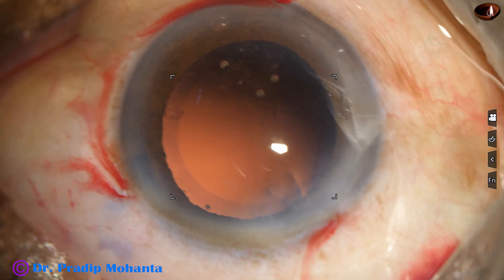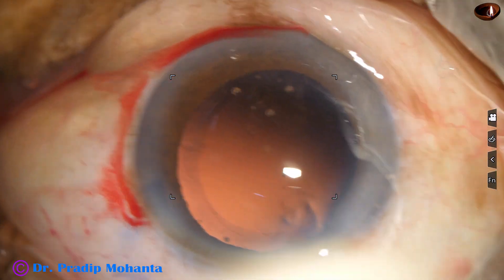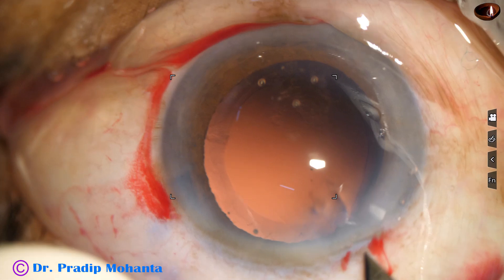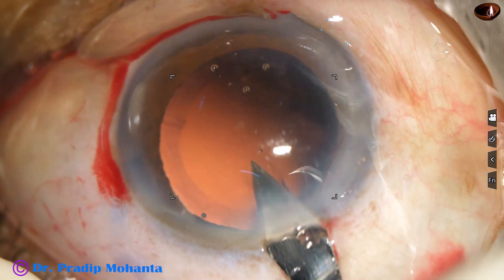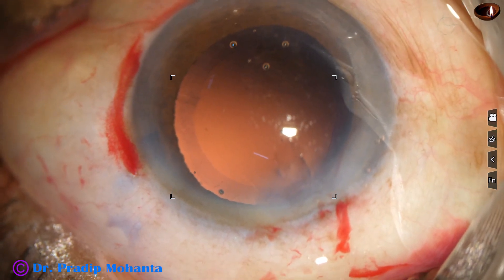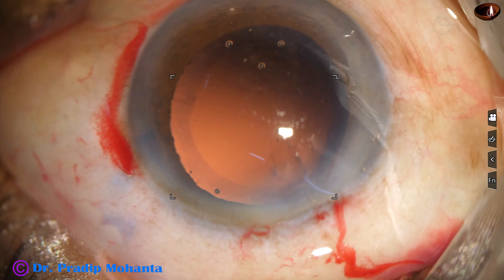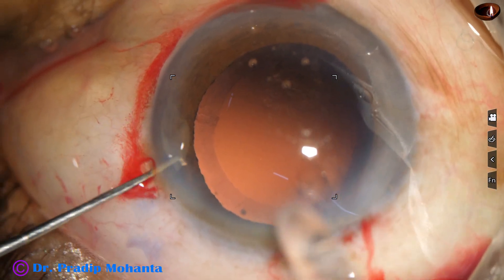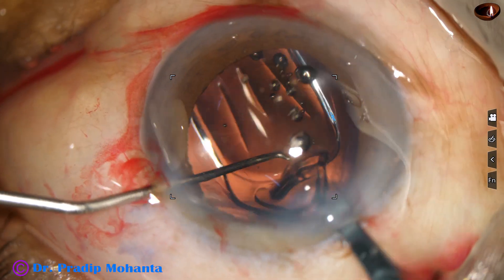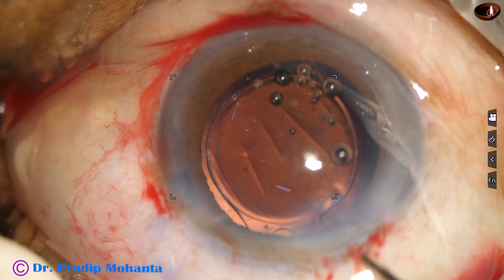I am filling up the capsular bag as well as the anterior chamber with visco — 2% HPMC. Then I enlarge the main wound by 0.2 mm, so the main wound which was 2.8 mm has become about 3 mm now. I use a B cartridge and implant a monofocal single-piece acrylic intraocular lens in the capsular bag. The lens has gone into the capsular bag.